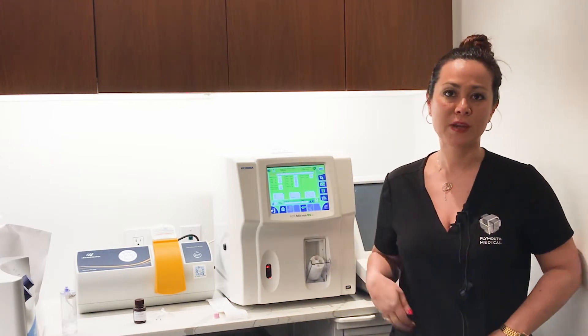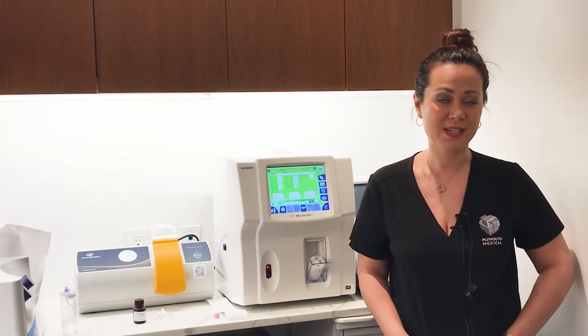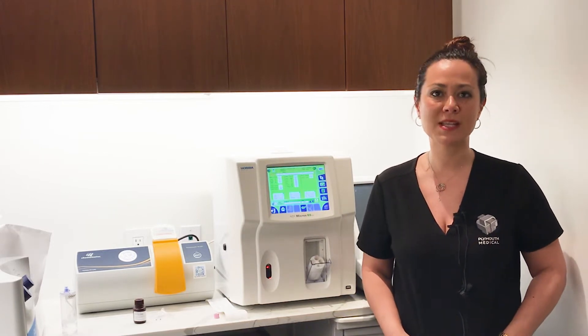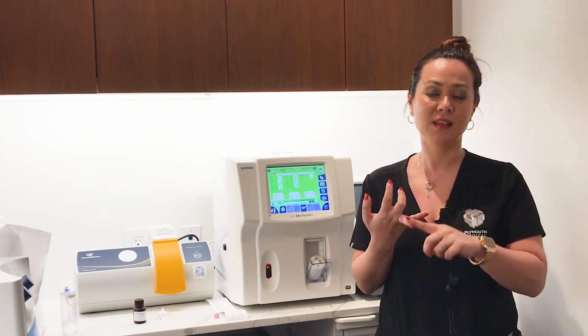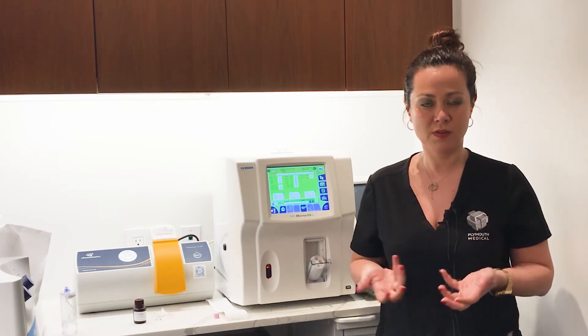Today we're going to do a little introduction on our Horiba Micros ES60 — that's a hematology analyzer. It's a three-part diff hematology analyzer, which means it actually breaks out the total white blood cell count into monocytes, lymphocytes, and the granulocyte family, of which neutrophils fall part of.